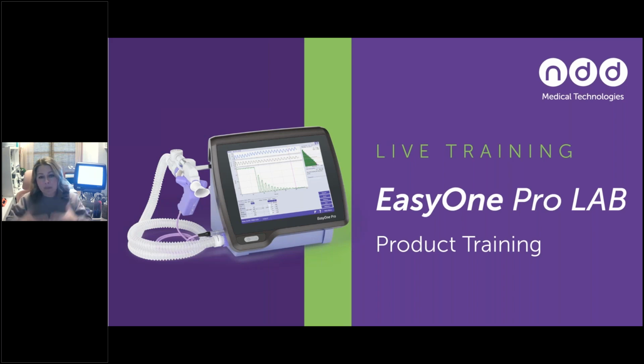Based on your patient's anatomy and their lung health at that time, different factors can affect what is going to be more accurate for that patient. But always, if you are comparing your single breath DLCO to your multiple breath washout TLC to your body plethysmography, know that there is a 10% leeway with any combination of comparison between those three numbers.